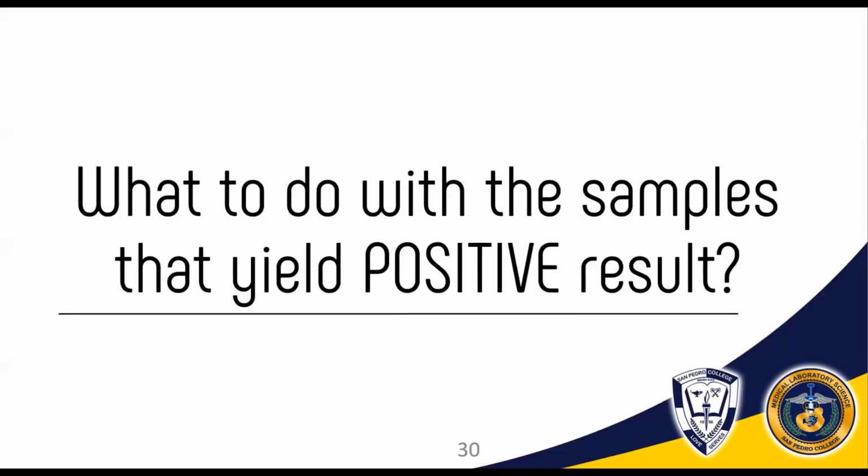Okay? Class, before I forget, tawag sa test, when the test is qualitative, it merely detects the presence of antibody or antigen of interest. So, for qualitative testing, it is reported as positive for the presence of antibody or negative for the absence of the antibody. For semi-quantitative, we determine the level, okay? The level of the antibodies or antigen present in the patient sample.